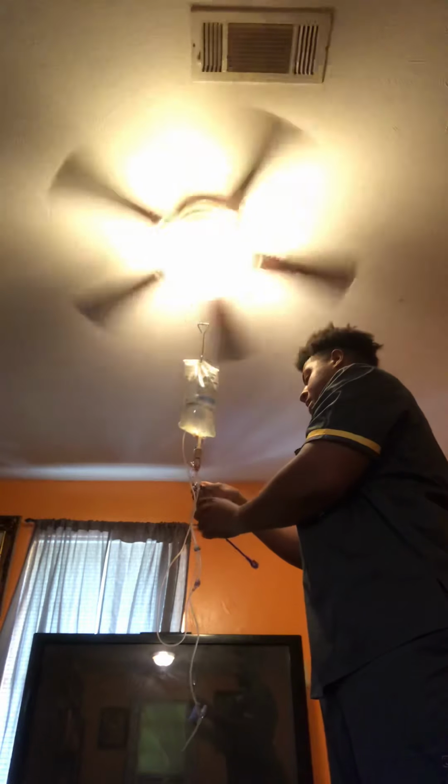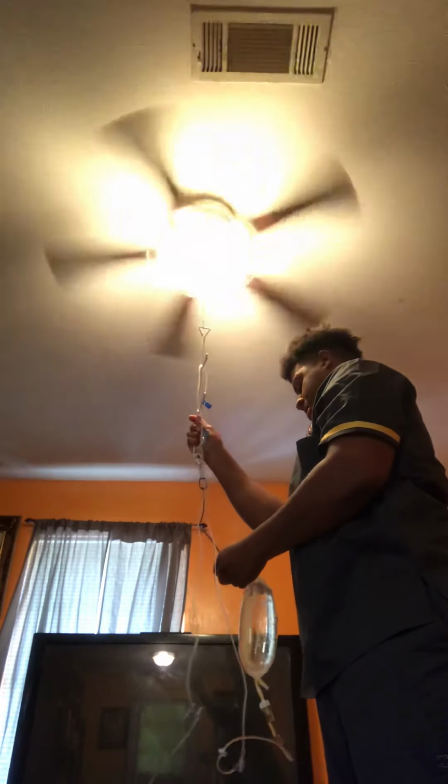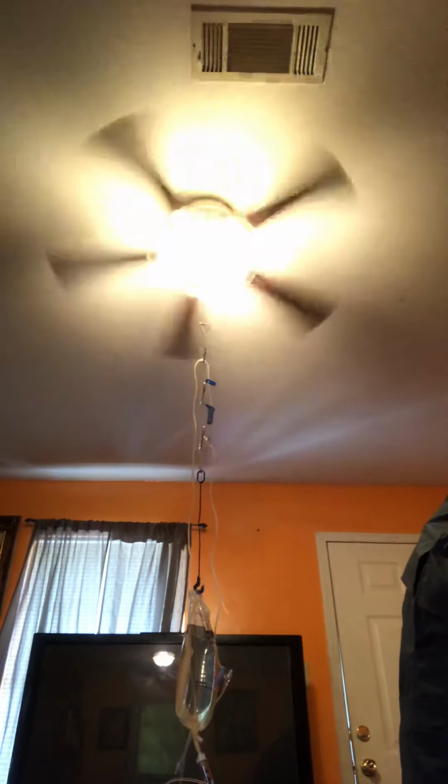All right, so first thing that you want to do is you have your medication. You want to get your hook and drop down this bag. So you want to put that down lower. Hang it from the hook, as you can see. And you got your tubing right here, which will be actually hanging down. And also, you need alcohol wipes, which I did not mention, but I have them right here.